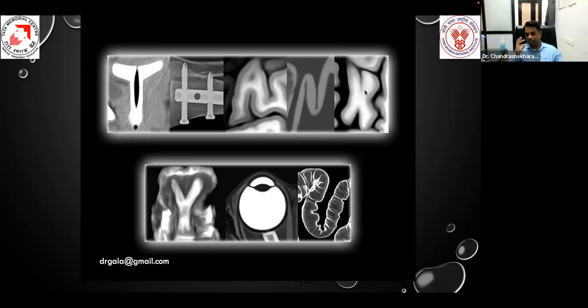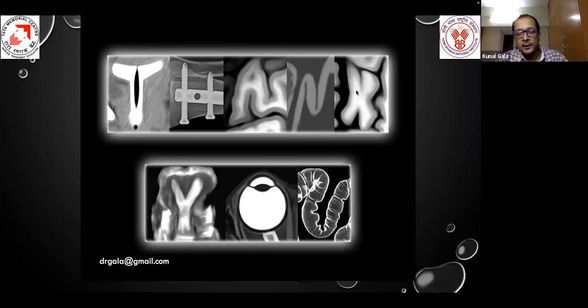And any tips and tricks for intraorbital biopsy if it is asked for orbital? Intraorbital, if it is done under ultrasound, nothing like it, because it is real time. Either too much lateral or too much medial approaches are generally preferred, because you can avoid the globe, the muscles and the neurovascular bundles. So going from the lateral or too much medial is generally preferable if the lesion is large and can be seen on ultrasound. If it can't be seen on ultrasound, then one can use a CT scan and take a lateral or a medial approach.